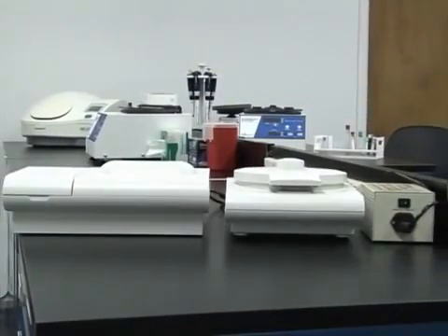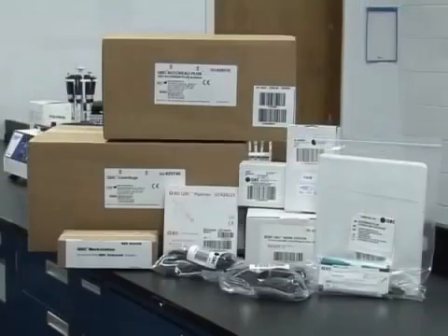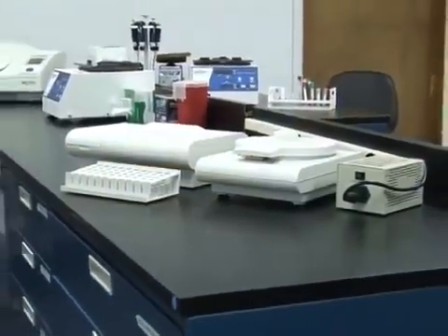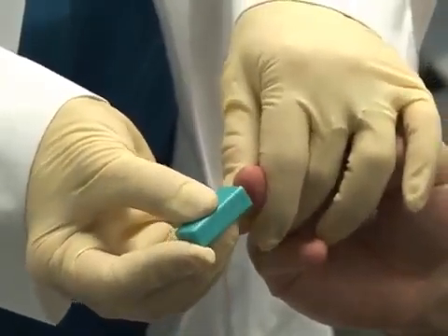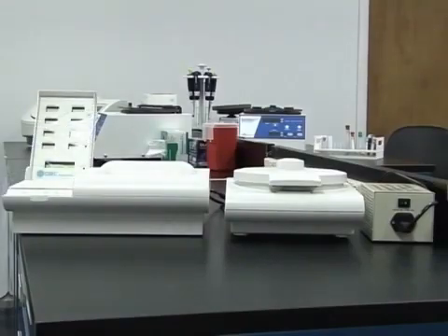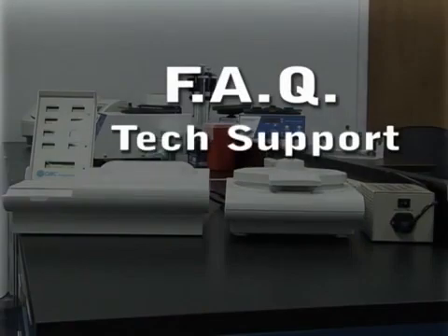In this video, you will learn how to assemble the Autoread Plus and centrifuge, learn what paperwork and supplies come with your system, and where to place the Autoread Plus instrument in your work area. We also have a section on how to perform a finger stick and how to work with and run the controls. Also included is a frequently asked questions page and contact information for our tech support services.